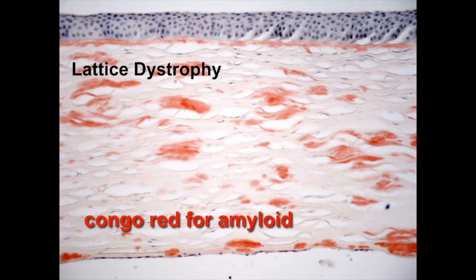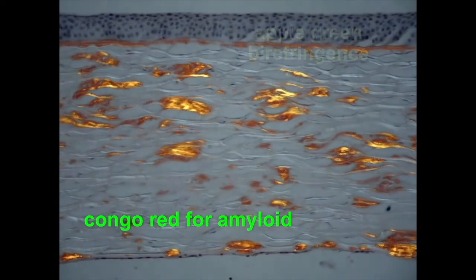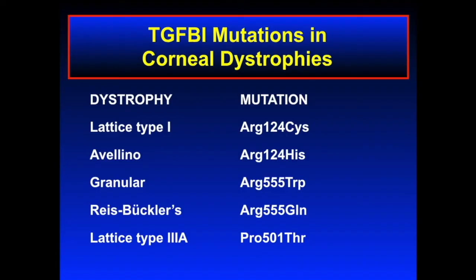And of course, we put our polarizing filters on and we can see the apple green birefringence. And if you rotate your filters, the green areas will turn orange. This is called dichroism, birefringence and dichroism. This is polymorphic corneal amyloid dystrophy, described by Gordon Clintworth. The amyloid in this dystrophy has been likened to ice chips.